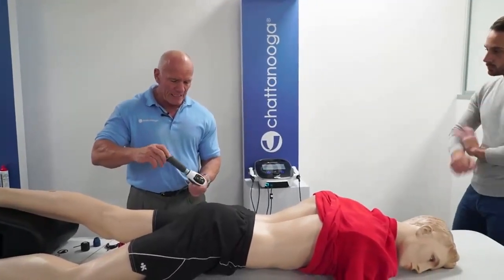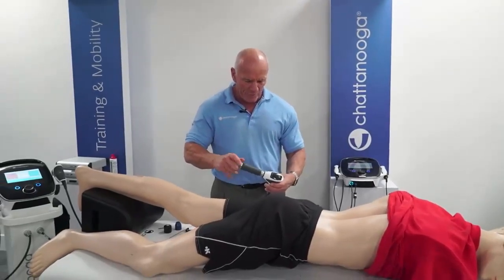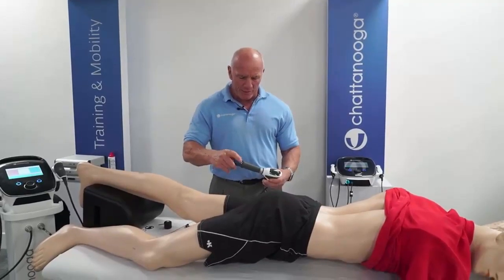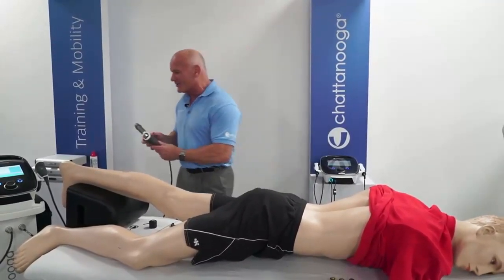And then you simply screw the whole thing back. The whole process takes you a few minutes. Put that out, by which time the kettle has boiled, and you can go enjoy your tea and coffee. Yeah. Excellent.